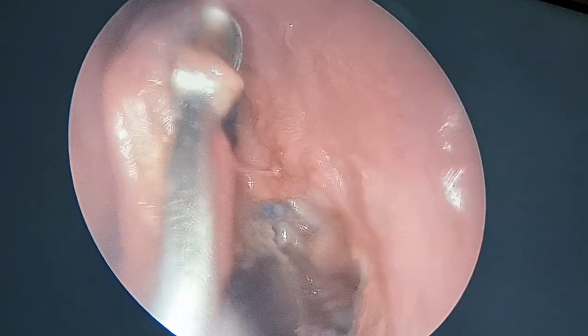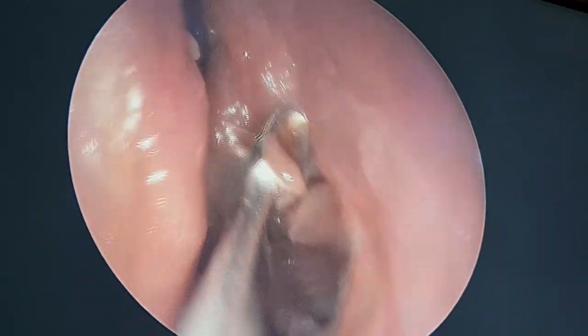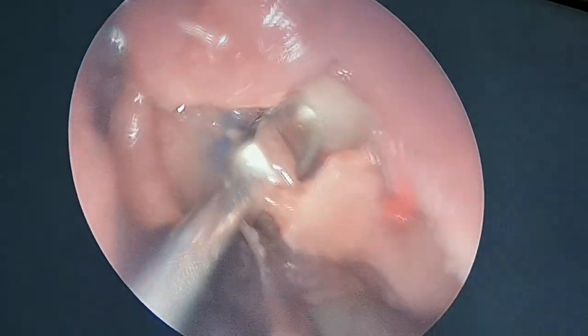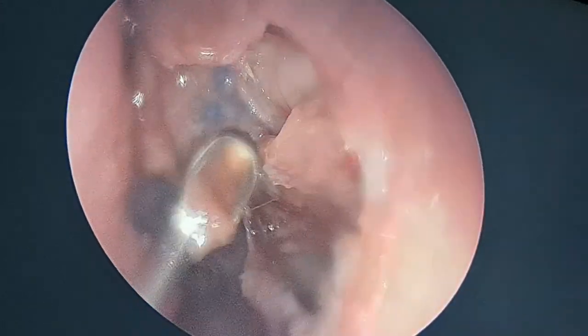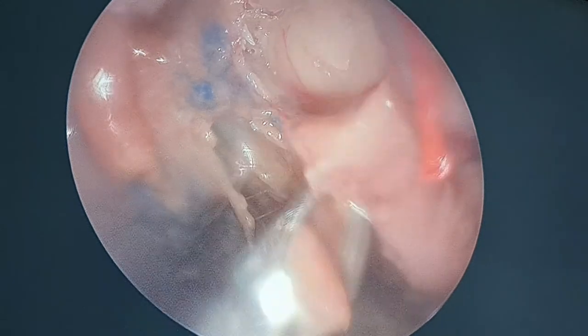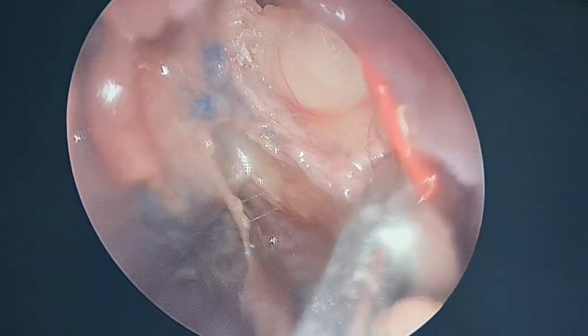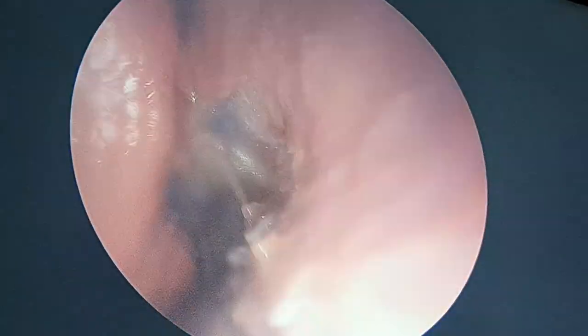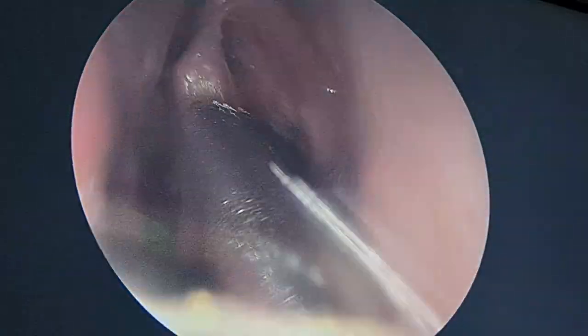That's why we have given up using the sickle knife, as explained, you can puncture into the lamina at the beginning of the surgery and then get orbital fat from that. So this is the accident. And see, this is the infraorbital cell, but a small infraorbital cell. What does this infraorbital cell do? This narrows the maxillary sinus outflow. So it is important to see.